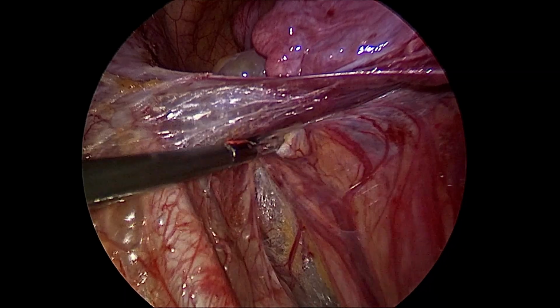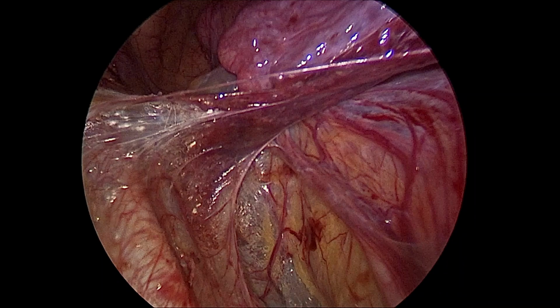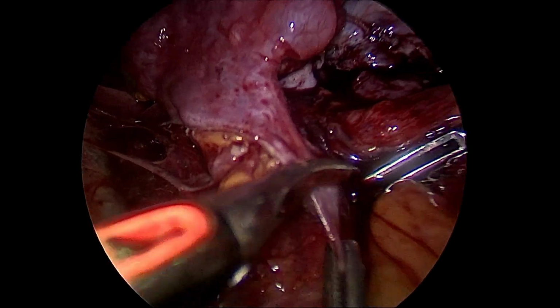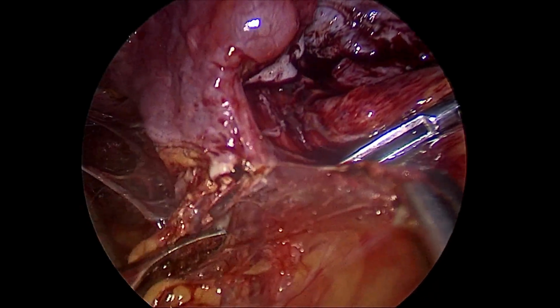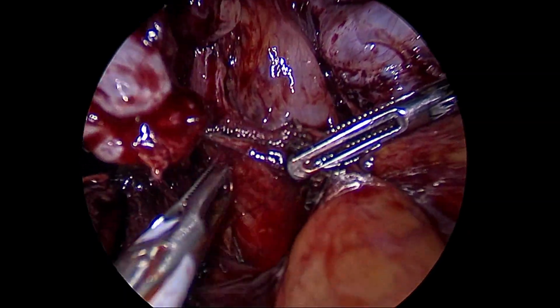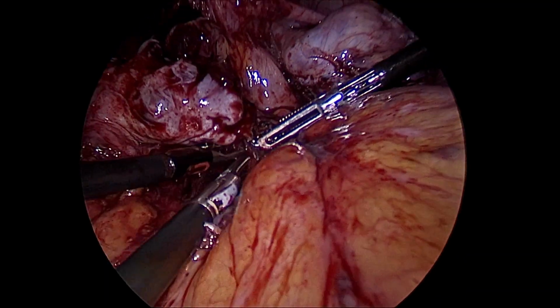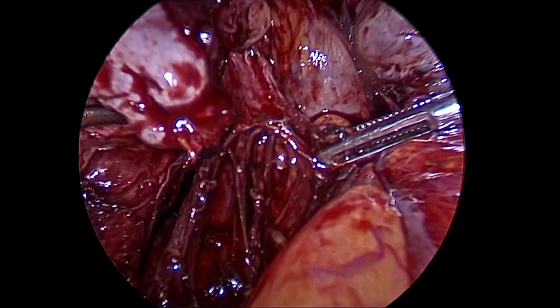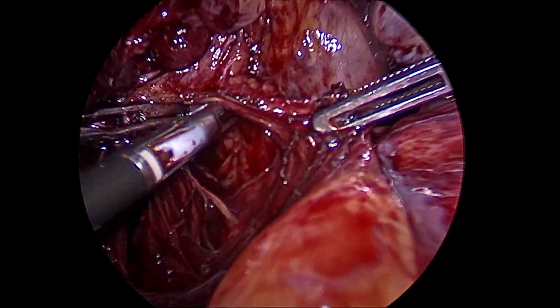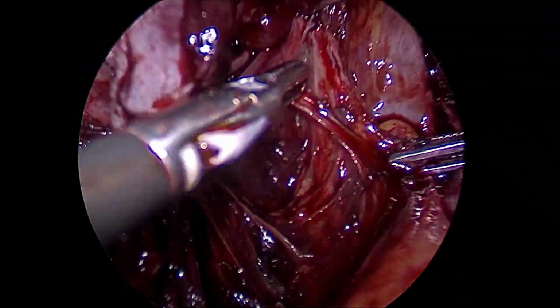As I mentioned previously, she is a 30-year-old girl who's seeking fertility treatment. So we will be doing a fertility preserving surgery. After the ureter is mapped out, we now come to the region of the pararectal spaces, and with dissection we will get the nice pararectal space between the infundibulopelvic ligament and the rectum. There, with just a simple bowel grasper and a bipolar shearer, we are creating this pararectal space.